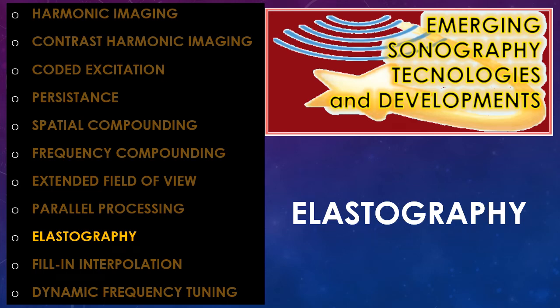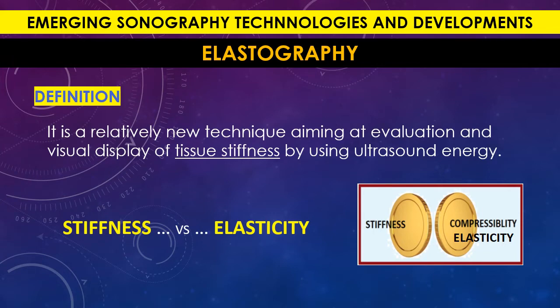Hello everybody, let's talk about elastography. Elastography is a new technique that has been developed lately in the ultrasound field and is aiming at evaluation and display of tissue stiffness. So what is tissue stiffness and what is elasticity?